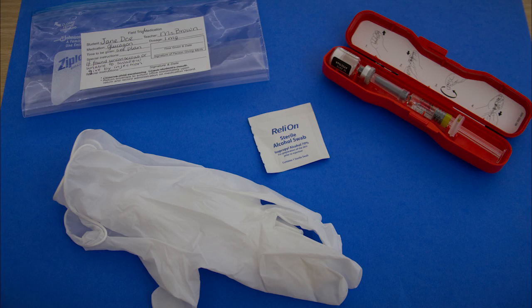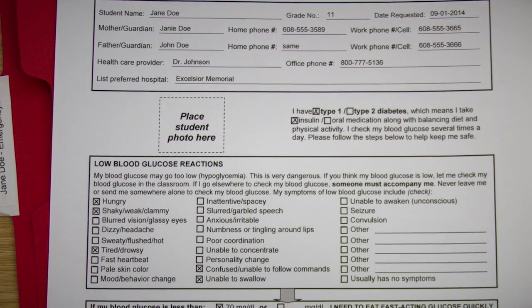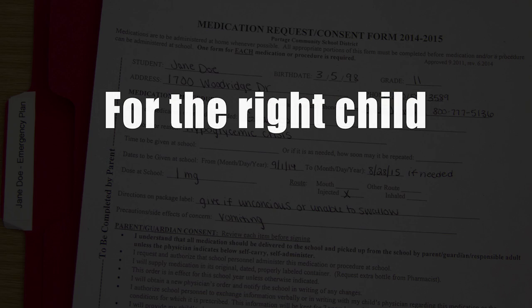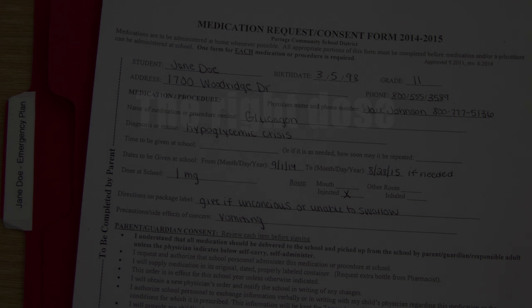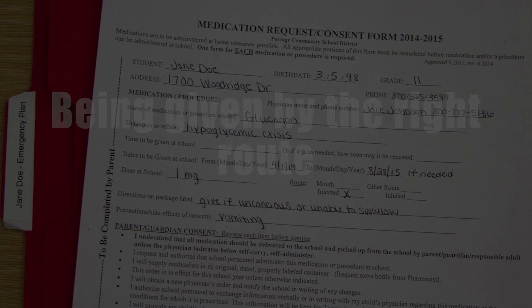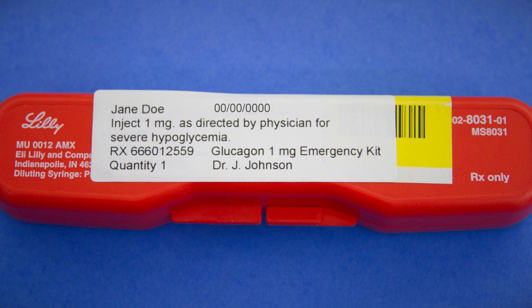Assemble supplies and place on a clean surface. Review the student's diabetes emergency action plan. Check the glucagon kit and order to be sure it is for the right child, the right medication, the right dose, being given at the right time, and being given by the right route. Also check to ensure the medication is not expired.